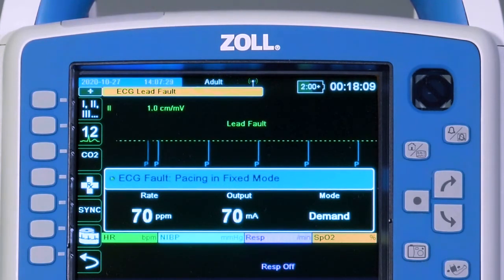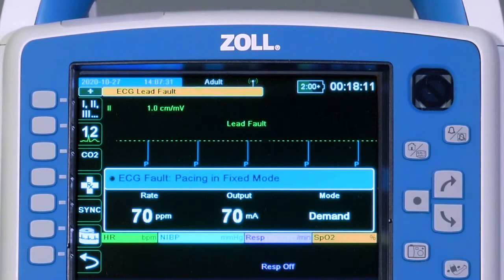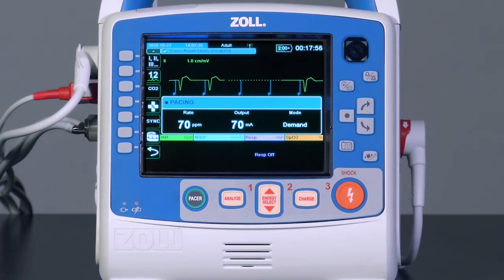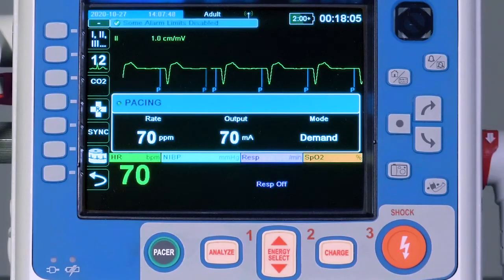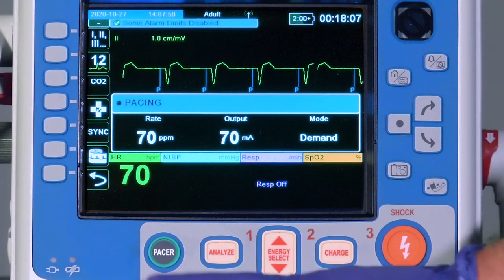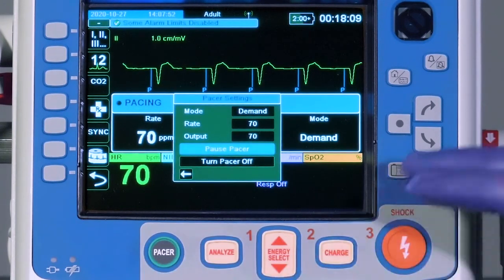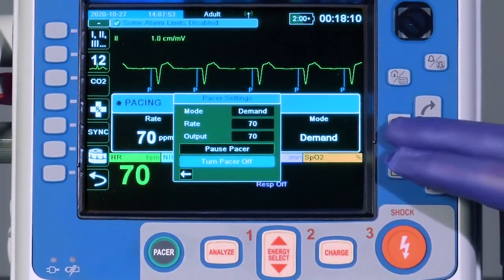Every attempt should be made to replace the removed electrodes as soon as possible. When reattached, the X-series Advanced will return to demand pacing. To discontinue pacing, select the Pacer button and select Turn Pacer Off.